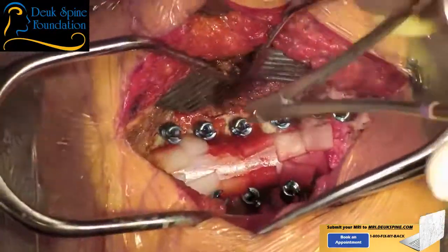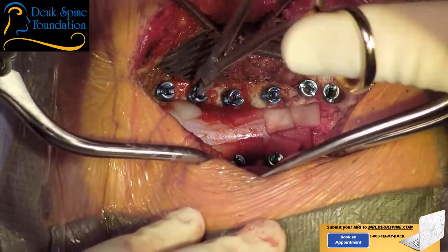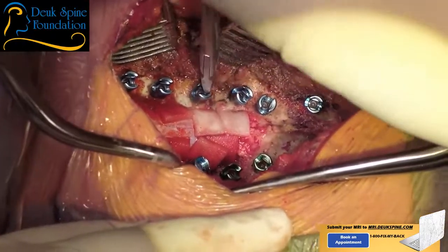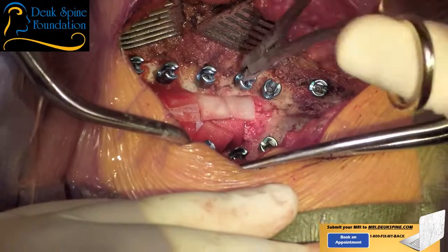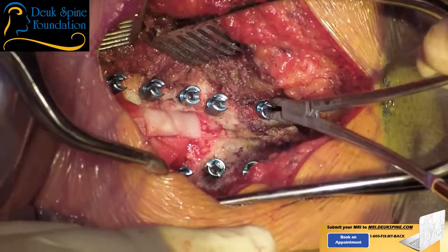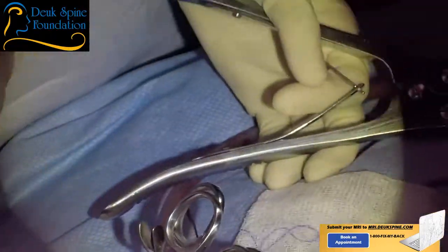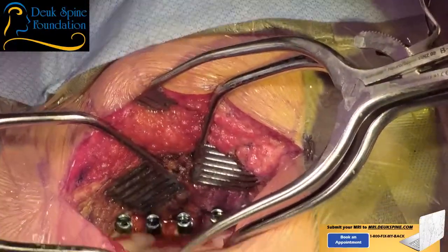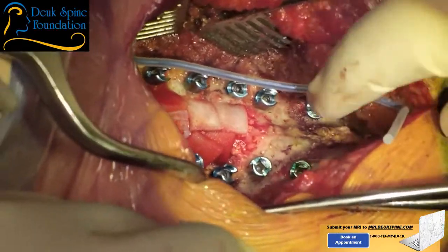All right, we are done placing our screws. Now we're going to mobilize the heads to line them up so we can figure out how long of a rod we're going to need. And then we're going to cut this rod with a very sharp cutter. We actually lost one of our employees once with a severe injury from the rod cutter. They bled to death.